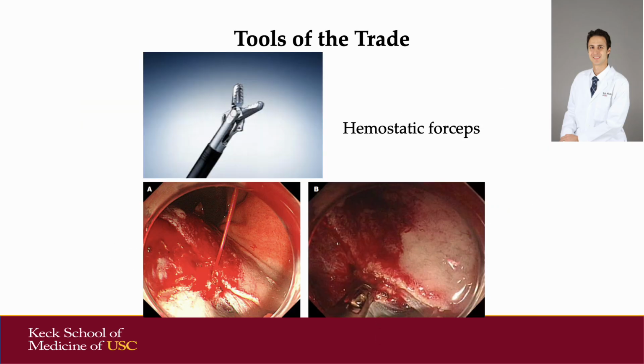Hemostatic forceps are crucial for performing ESD and allow for adequate hemostasis in the setting of significant arterial bleeds. This is very useful rather than trying to use a clip, which could potentially obstruct the view and make it more difficult to continue on with the ESD procedure.